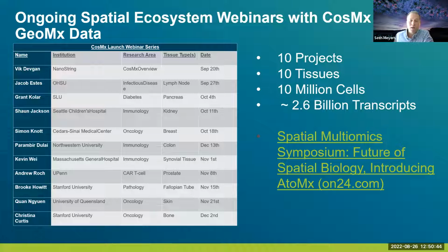Yes, the protein expression is quantifiable. It does provide quantitation of that particular protein or antibody that's present within the sample set, and there is a list of validated antibodies. From the GeoMx system, we do have a listing of the specific proteins we have included within that.